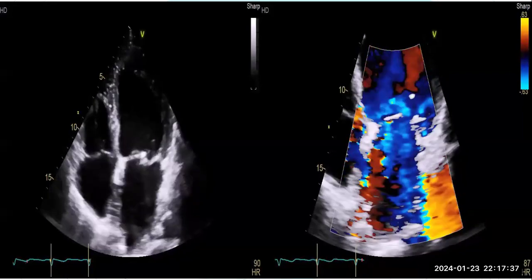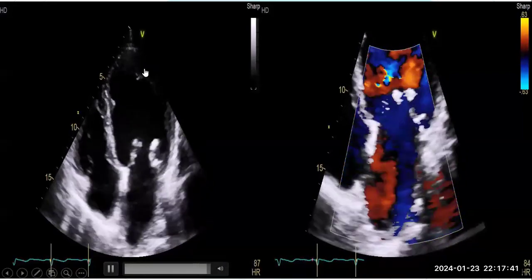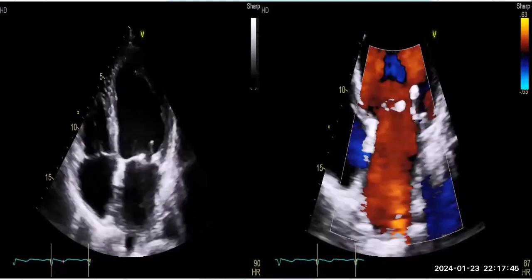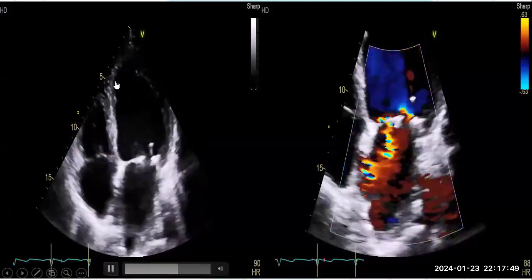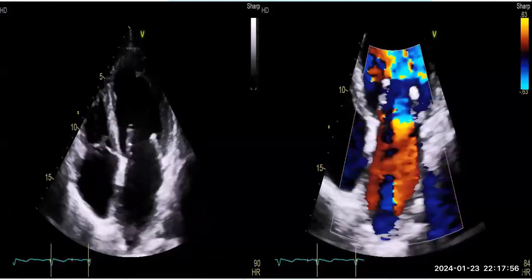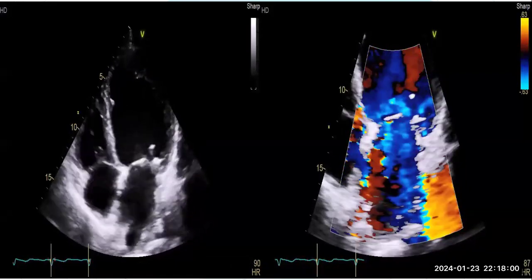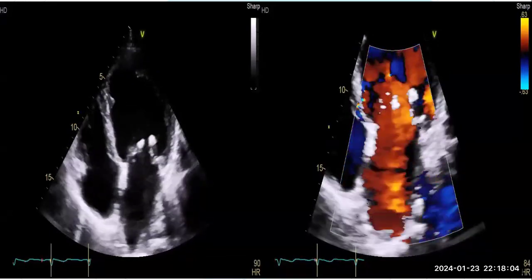I'm looking at an apical 4 chamber with a thickened mitral valve with hypermobility, especially in the anterior leaflet, and a probable prolapse of the posterior. I'm thinking that there's a flail mitral valve and there's significant regurgitation as well. Okay. Good. Again, could you describe the mitral leaflet for me, please? The posterior leaflet is prolapsing into the LA.